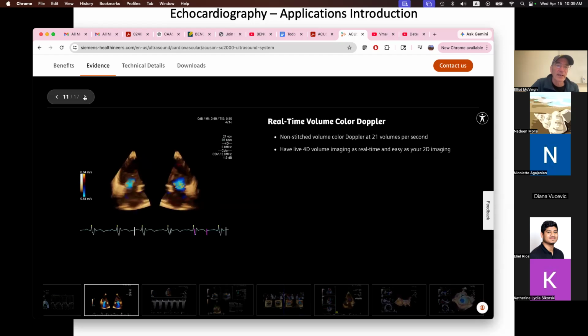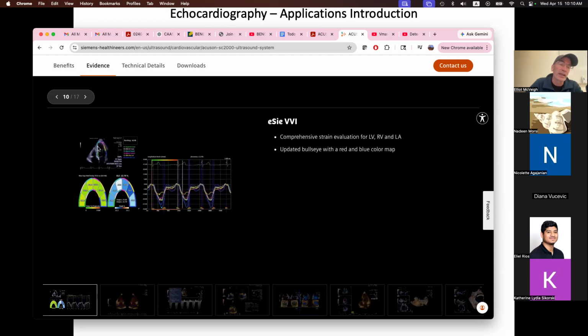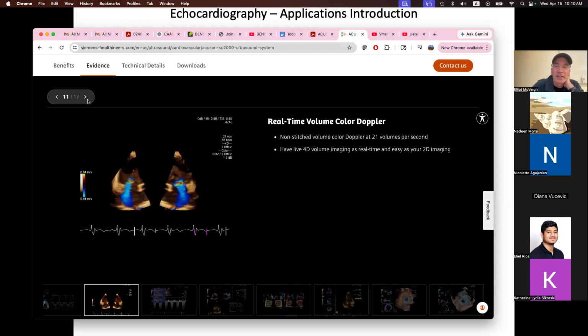And MRI is really good at that. We'll see that with MRI, you can do this type of functional map, but make these elements not a big long yellow thing on one half of the septum. You can make it literally a 3 mm box and see how the heart is functioning on that level.